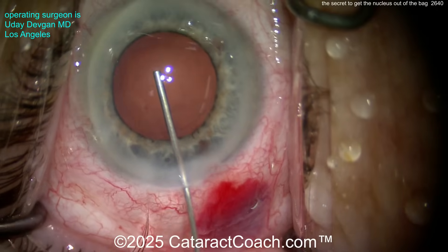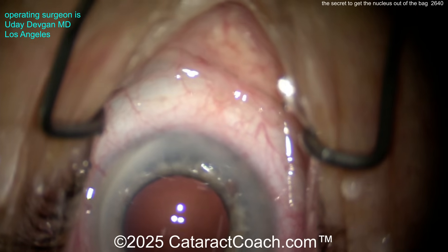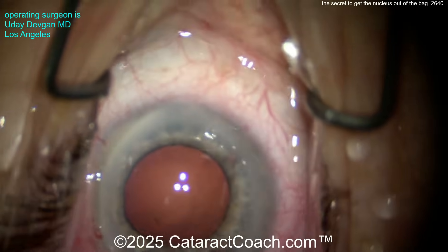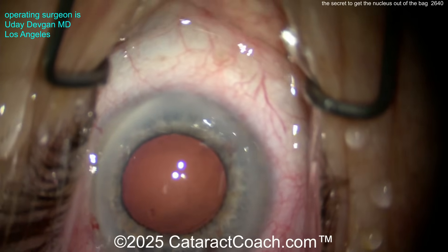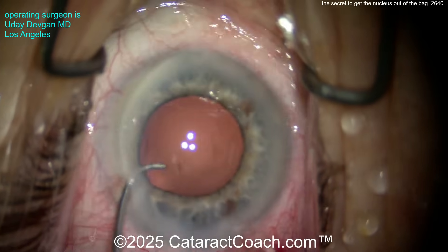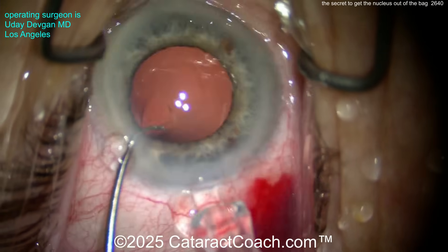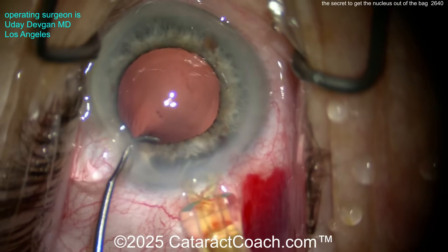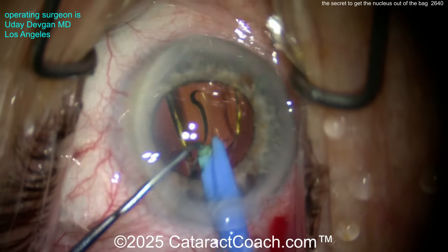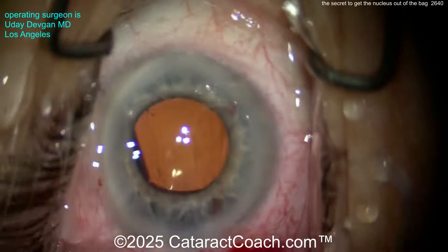Here's the viscoelastic going inside — a nice, big fill. That's a cohesive agent, fills up the bag very nicely, and is easily removed at the end of the case. Here comes our lens: it looks like a single-piece acrylic in the injector tip, a one-handed injector. Probably a monofocal lens. It starts to deliver — there it goes. Beautiful. Monofocal lens, looks great, goes into the capsular bag. Now make sure both haptics and the optic are within the bag.